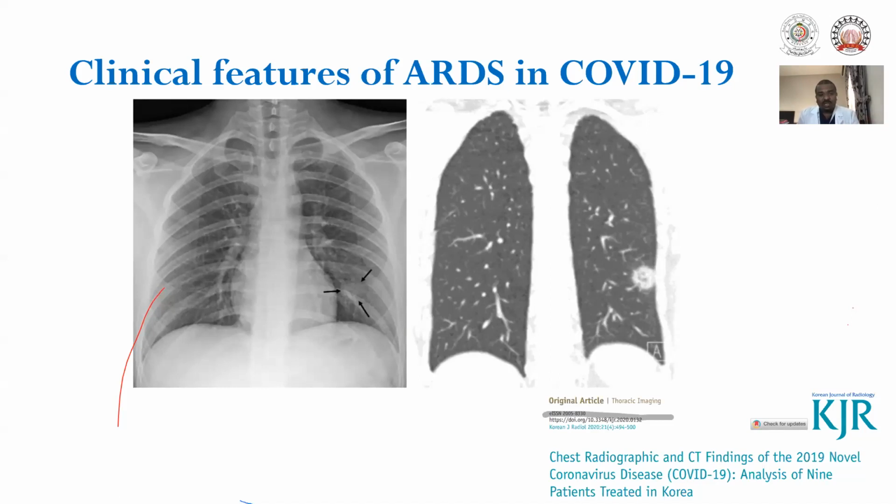Also, ECMO has been reported to be used in acute exacerbations of COPD, which is a strategy which could significantly alter the current management paradigm. You may have seen this in the references as well. I just wanted to mention it.